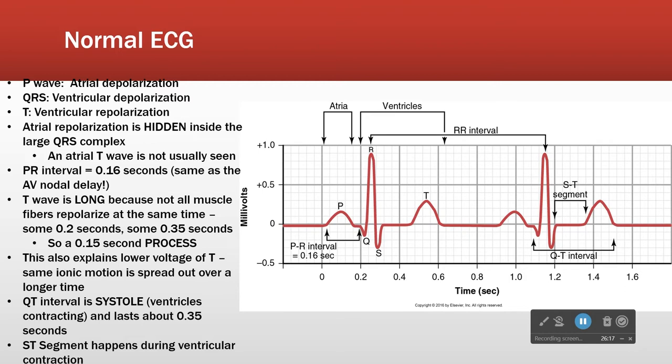Yes? And you said you would say the QT ends at the beginning of the T instead of at the end, like it shows there. Yes, I would say Q to T. There are different ways of defining intervals, but we're going to call it that way for now.